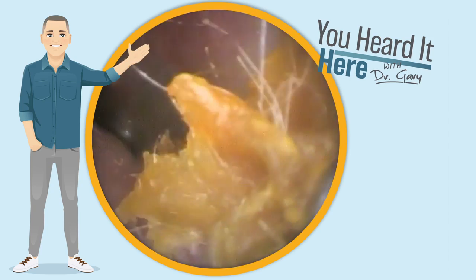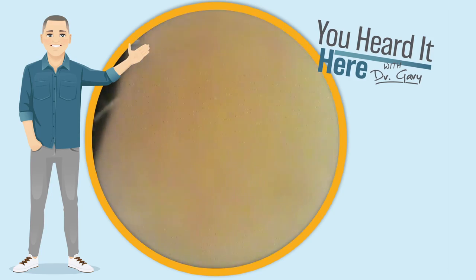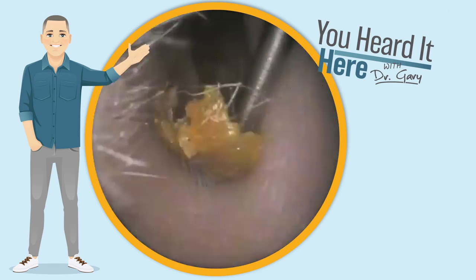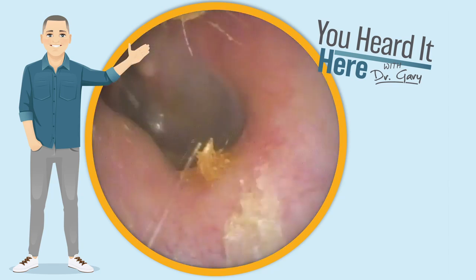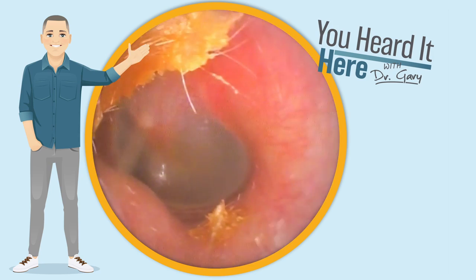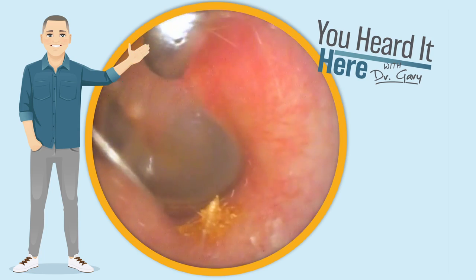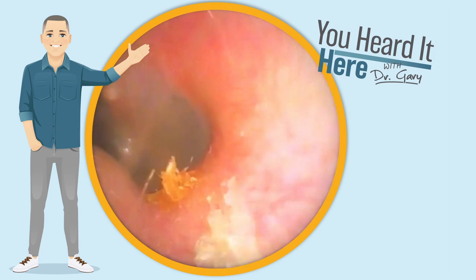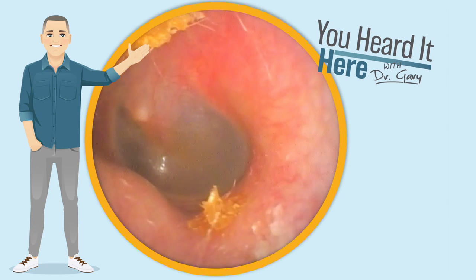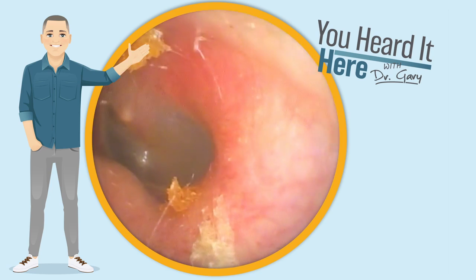In one of our previous videos, we talked about how using the right tool for the job makes a huge difference. As you can see here, we're using a curette that is relatively straight, with a very mild angle on it. But as we look up to the top left of the ear canal, we're going to see some earwax that is very difficult to get to with a curette in this shape. So we're going to switch to a different tool — a curette with a more angled end. This will allow us to get in behind the earwax and pull it away from the ear canal wall.